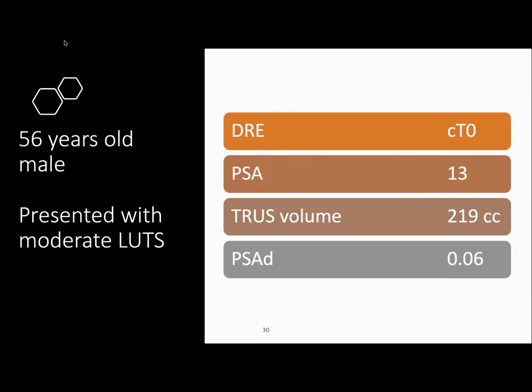I think this is technically very demanding, but for urologists and urological trainees, some of these things are difficult to follow. But this presentation is recorded and it will be available on the PAUS Karachi website from probably over the weekend. Sharif will make sure that these are available, and you can go through this again at your own leisure. So we'll now take some cases, and we'll seek input from our panelists about what are the possible things seen in these cases.